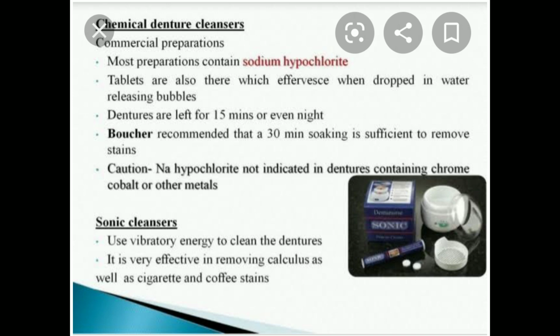Then there are chemical denture cleansers. Most preparations contain sodium hypochlorite. According to the Boucher textbook, there is a recommendation that a 30-minute soaking is sufficient to remove stains. Dentures are left for 15 minutes or even overnight. Tablets are also there which effervesce when dropped in water, releasing bubbles.